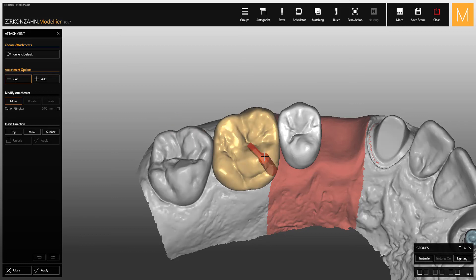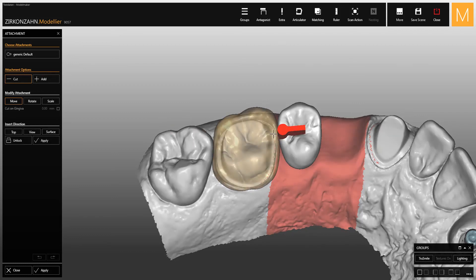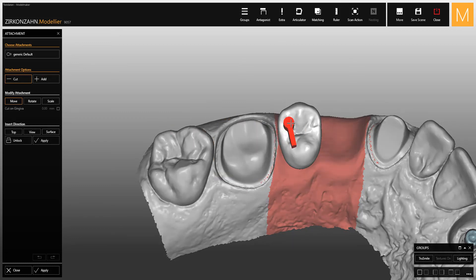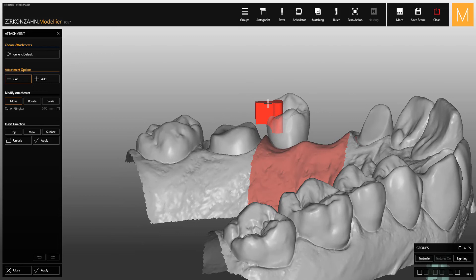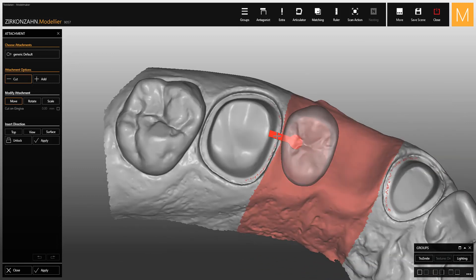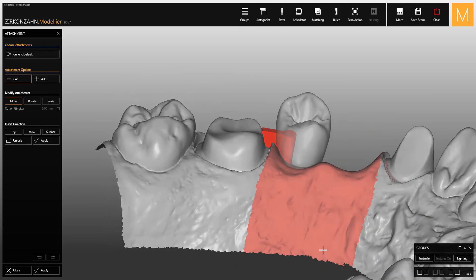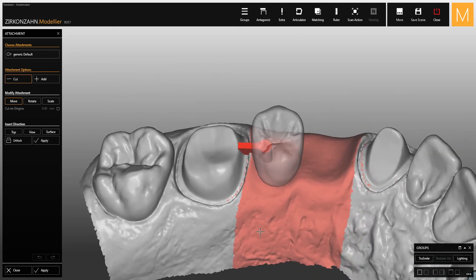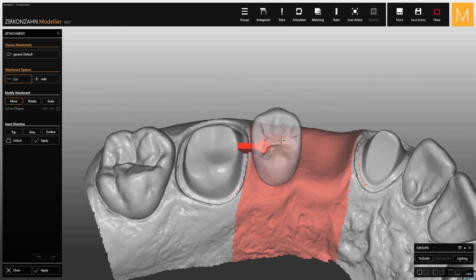The attachment color changes to red. Place the attachment as described above, then click apply to proceed with the cutout.